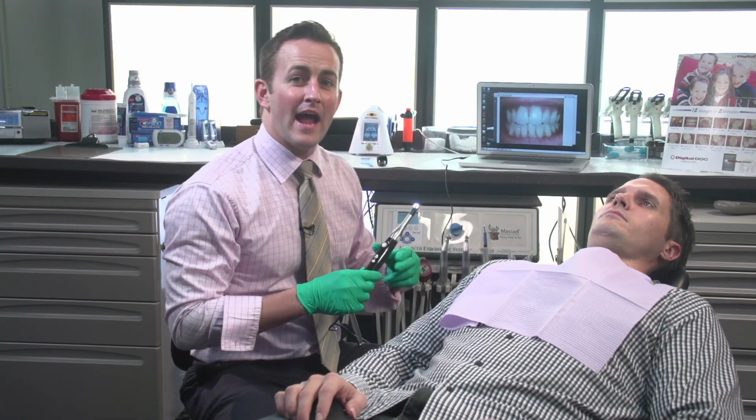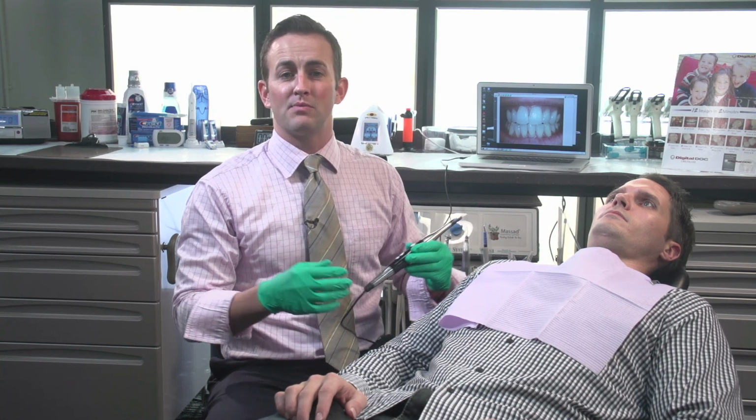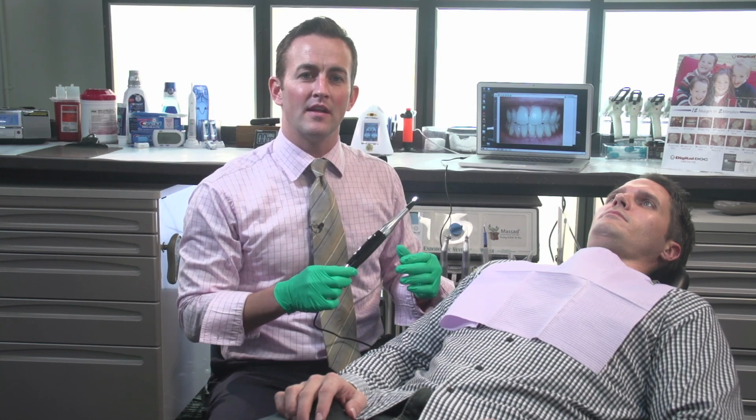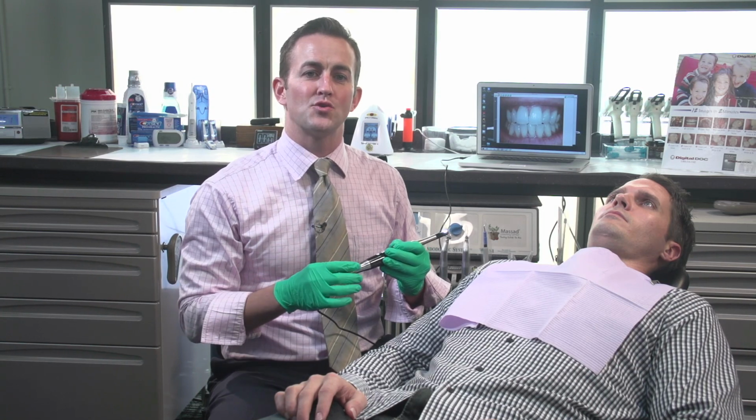With this poster as my guide, I will show you how to capture these images while operating the iris camera and fulcrum in your hands properly. Now, before we get started, let's do a brief overview of the settings of the iris. We have a designated variable focus camera with 2 extraoral settings and 3 intraoral settings.